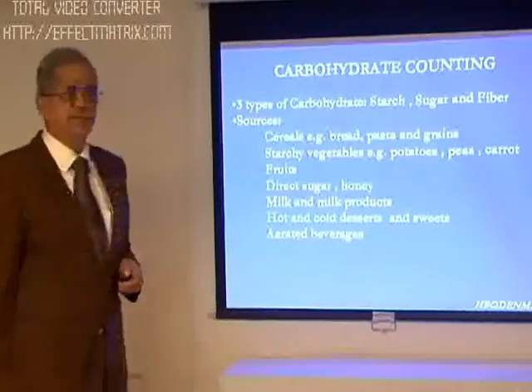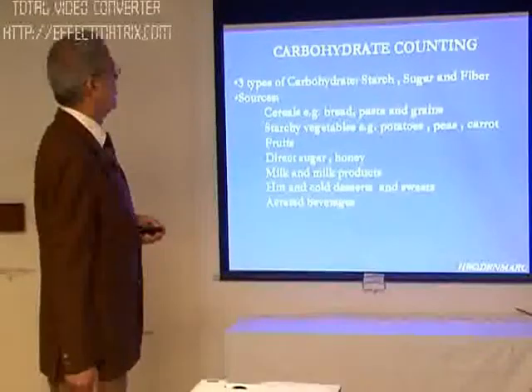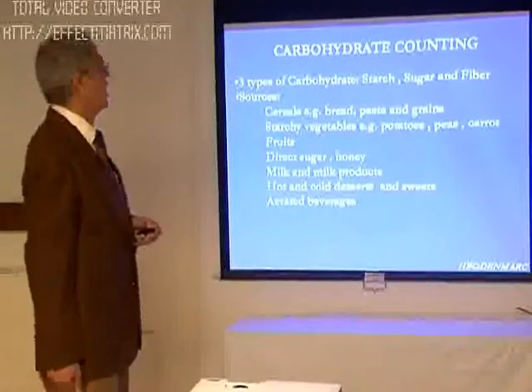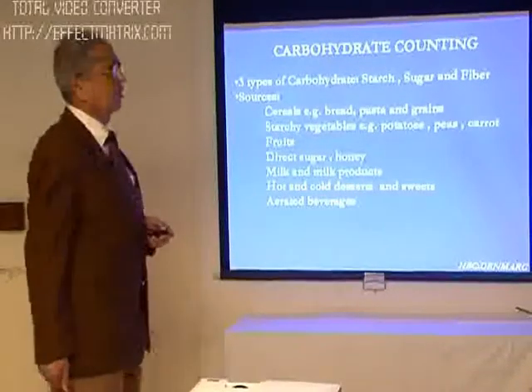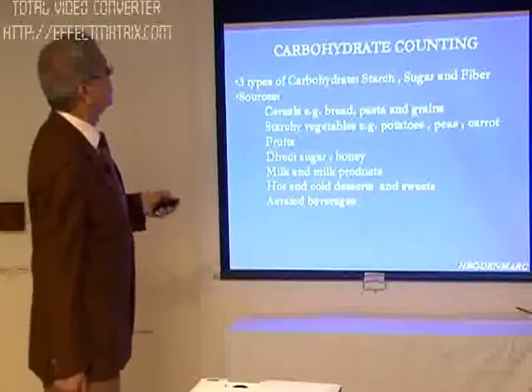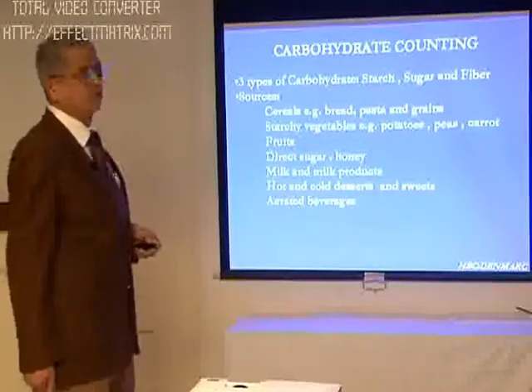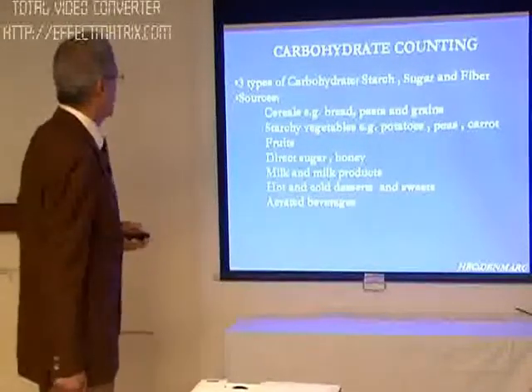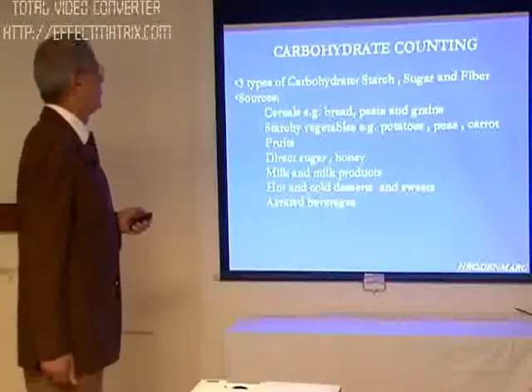To start with, one divides 500 by the total dose and takes that as what is called the insulin carbohydrate ratio. But you have to evaluate in each patient whether the index you are using as insulin carbohydrate ratio is the correct one or needs to be modified.